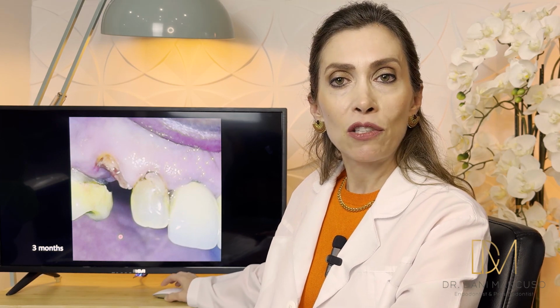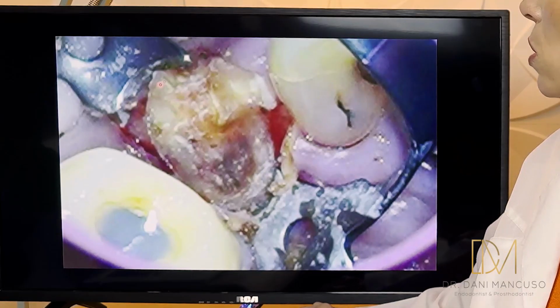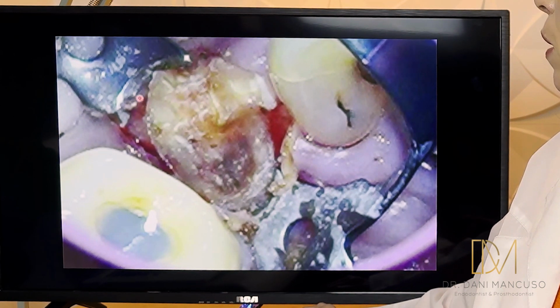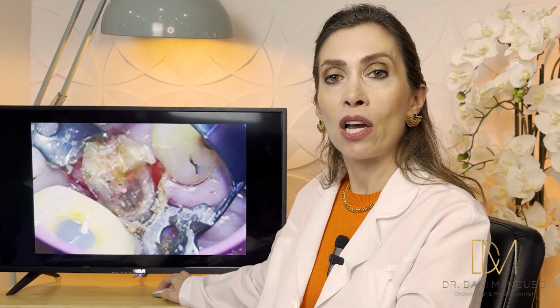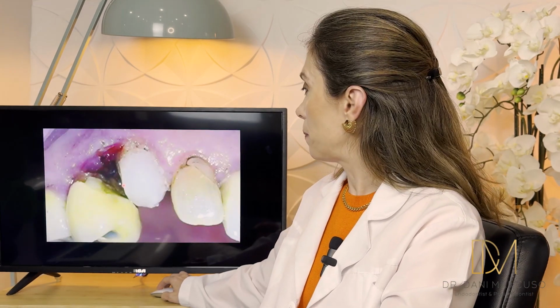Between the fiber post and the metal post, I decided to use the fiber post. I think the modulus of elasticity is similar to the tooth, and I think it will work better when you have little tooth structure. So we chose to do the root canal treatment and restore that tooth because it had a long root. As you remember, we adapted the clamp, the anterior clamp, and did a small gingivoplasty to expose the margin completely. It was quite calcified after removing the decay, but of course it needed a root canal treatment.